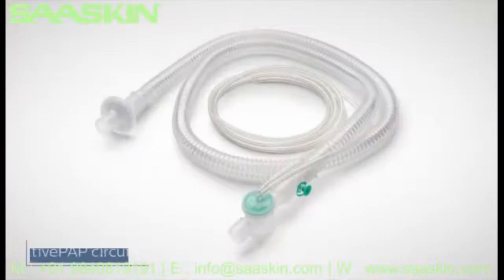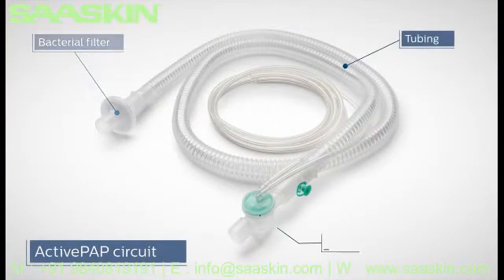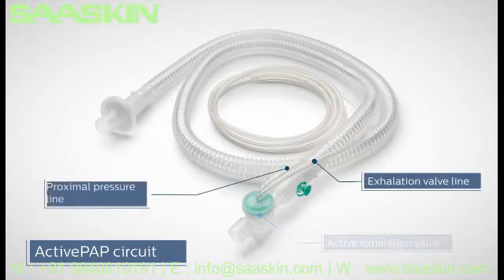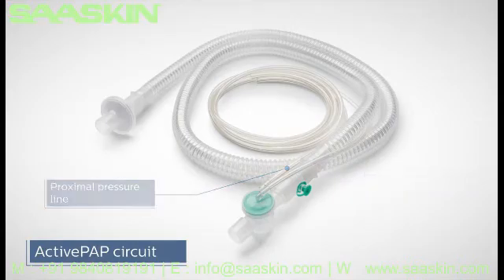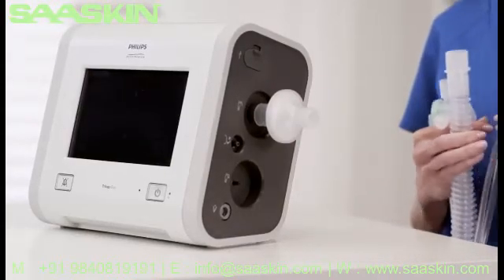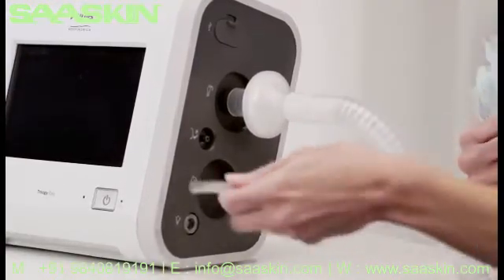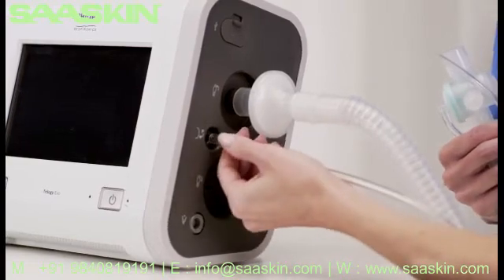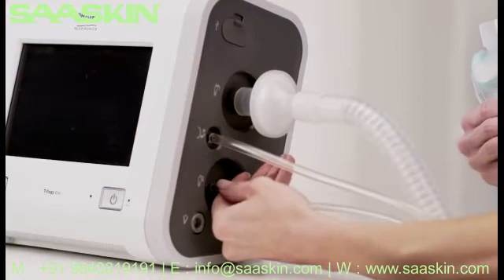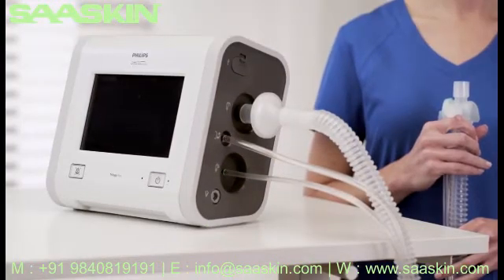The active PAP circuit consists of a bacterial filter, tubing, active exhalation valve, exhalation valve line, and the smaller proximal pressure line. Connect the bacterial filter and tubing to the inspiratory port. Now attach the proximal pressure line to the proximal pressure port and the active exhalation valve line to the active exhalation valve connection. The active PAP circuit is now complete.